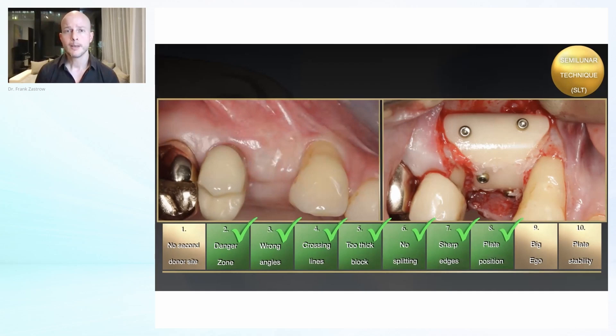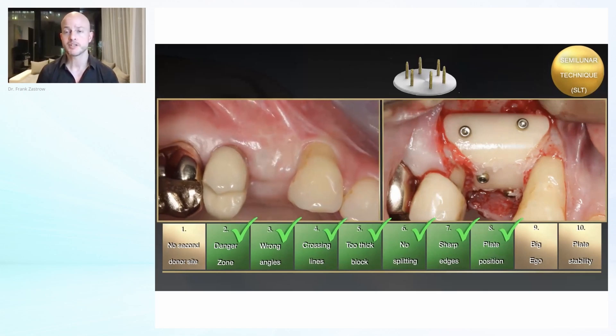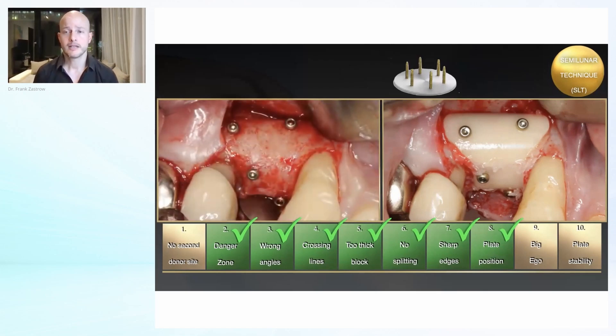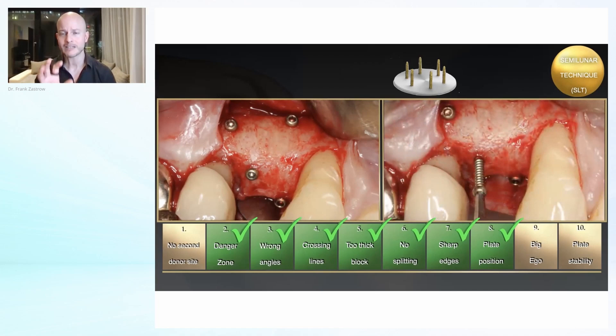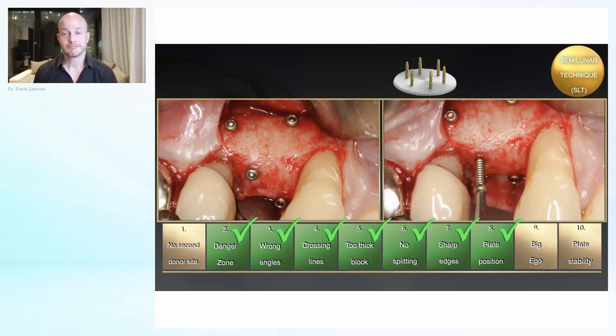Going back to this case after three to four months — you see that the results are always nice. I'm sure many of you have already seen cases with the shell technique working with the split bone technique in social media or from other speakers. In my opinion, there is no way around it: everyone who wants to become an expert needs autogenous bone in their toolbox, because otherwise you will never be able to handle more complicated cases. You can see again these nice blood vessels — this is real bone.